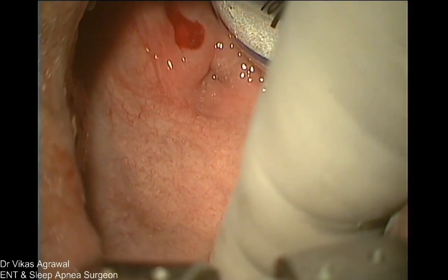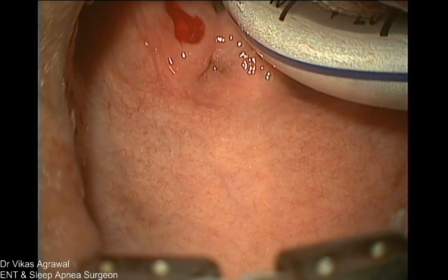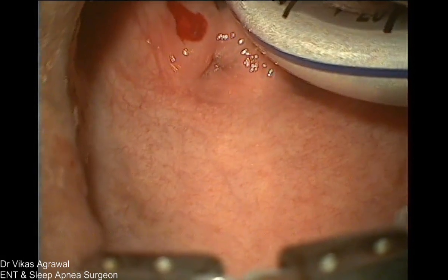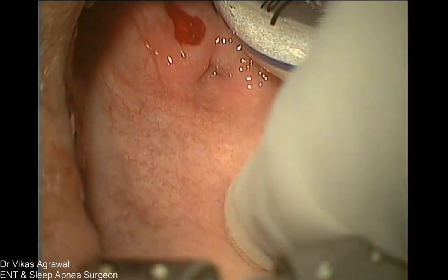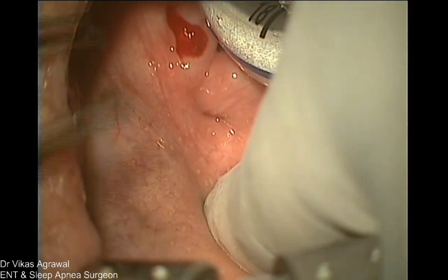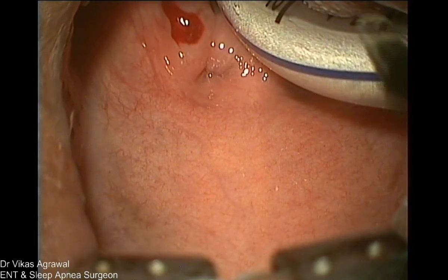Yeah, this is a microscopic picture. We have the Zeiss Opmi Vario attached to the camera, and that is how we prefer to do this surgery, under magnification to identify all the important structures. The question is whether the picture is from the microscope. Yes.